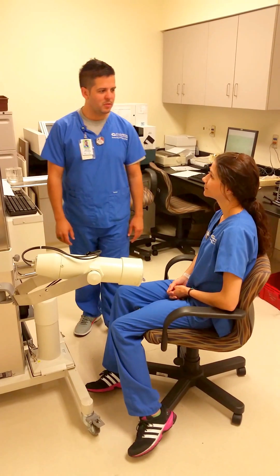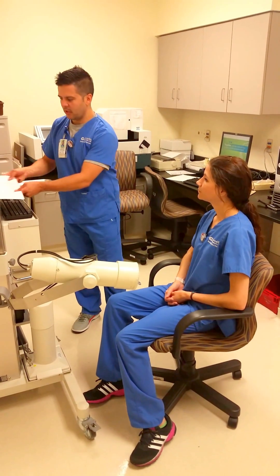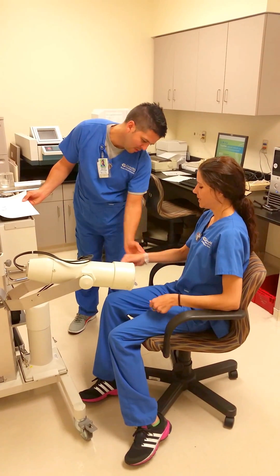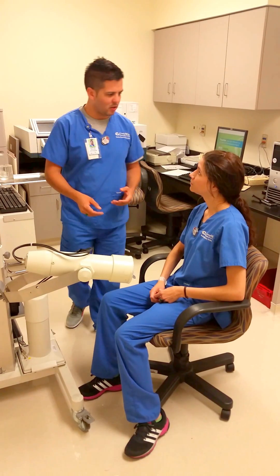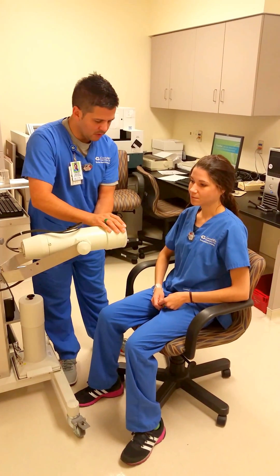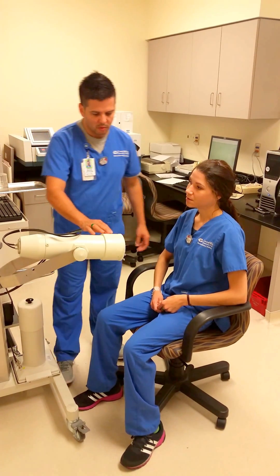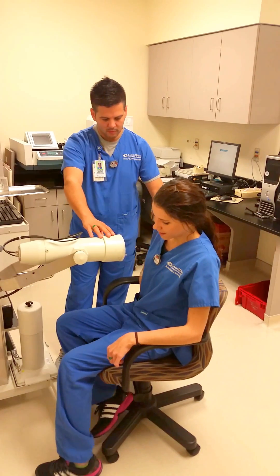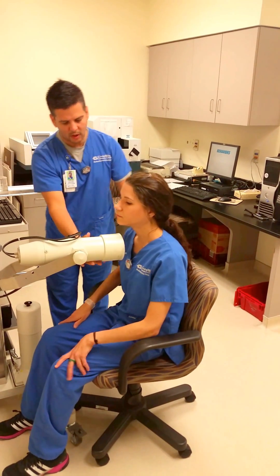Our patient's back for her uptake portion of the test. I'm going to have her verify her name and date of birth again. Gateway student, 1-1-87. Excellent. So this is going to be like the longest two minutes of your life — your chin is going to come up onto this probe here. It's going to take a measurement of how much iodide is actually in your thyroid from that capsule I gave you. I have my cell phone in my pocket — is that okay? That's going to be perfectly fine because this is only going to be right in front of your thyroid.